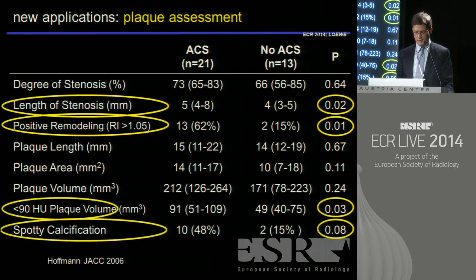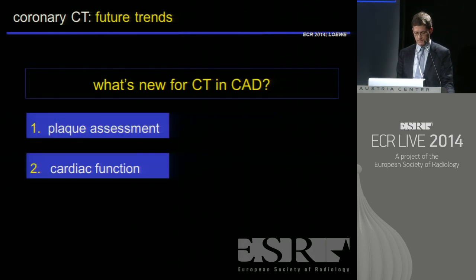So this could be a very interesting and important thing to go for in the near future, if CT shows in the clinical routine that it is able to demonstrate even the plaque morphology. Mentioned before by Marco, how important even the cardiac function might be.